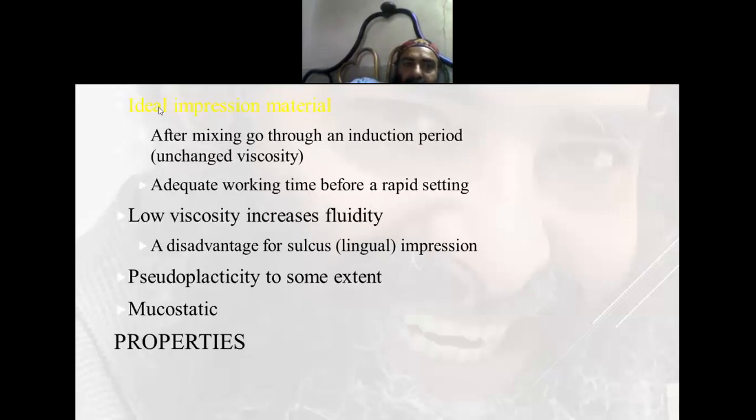Now, sodium alginate is an ideal impression material. Why? Because after mixing it goes through an induction period.